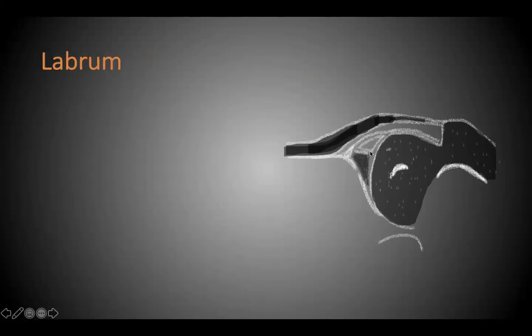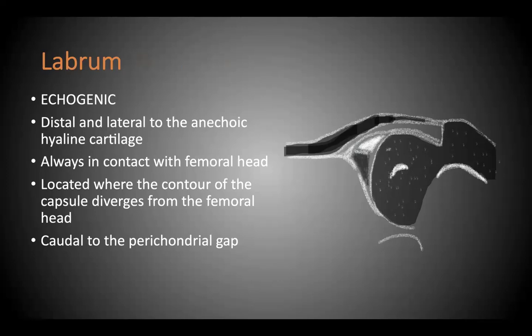Then comes the labrum. The labrum is an echogenic structure which is in close contact with the femoral head. And there are 4 ways in which you can identify the labrum. Firstly, it is echogenic. Then it always lies distal and lateral to the hyaline cartilage.